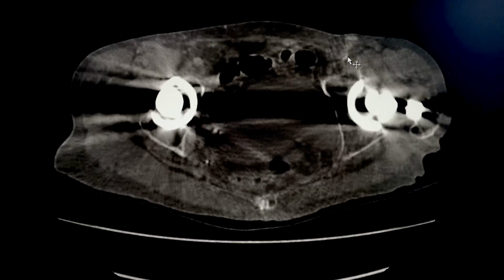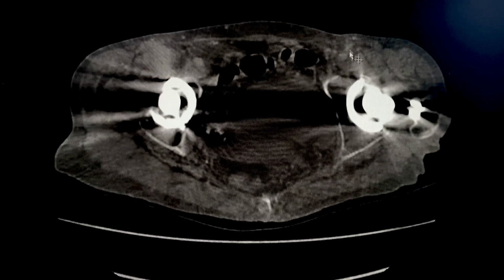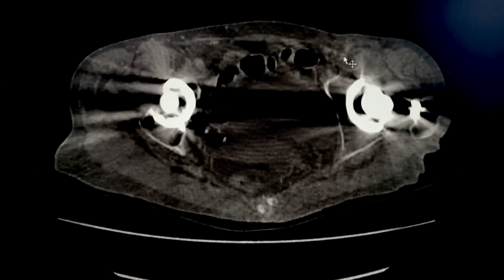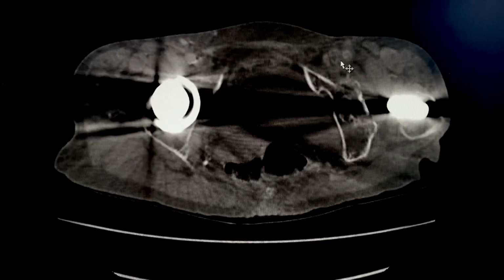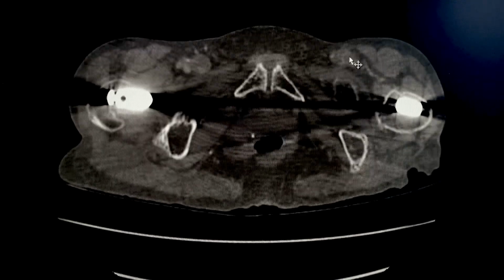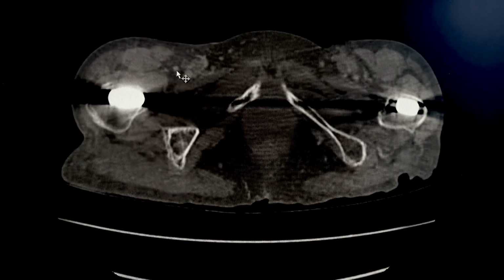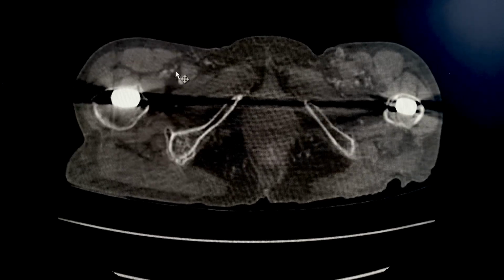At the bifurcation of the common femoral artery into the superficial femoral artery as well as the deep femoral artery, both the superficial and the deep femoral arteries are occluded, right? As it is on the left, so it is on the right.